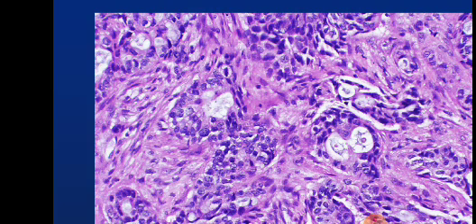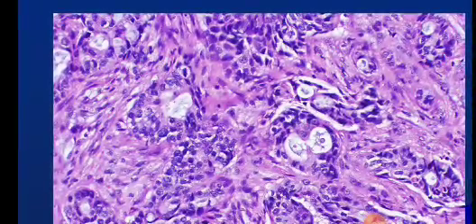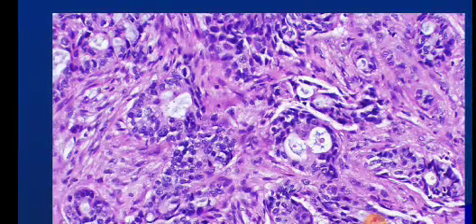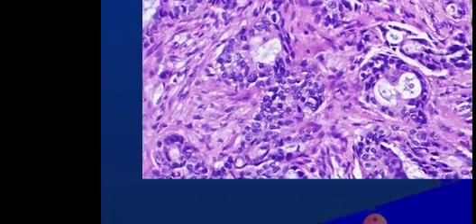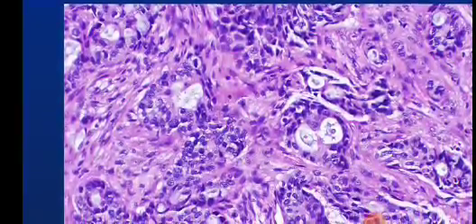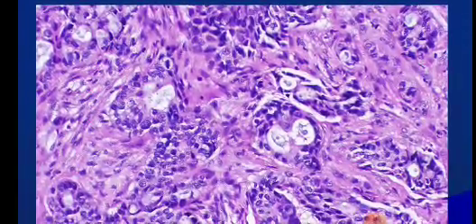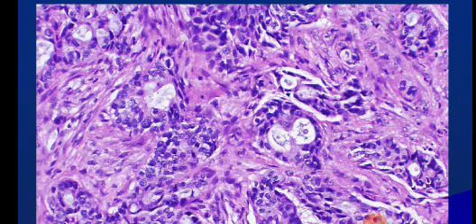Increased abnormal mitotic activity. How do we detect the mitotic activity? When the nucleus becomes irregular in shape, there is a straight line, or they form a Y-like structure or irregular figures inside the nucleus. This is known as a mitotic figure, and this is surrounded by fibrostroma, and you can see the malignant cells inside the fibrostroma. Means there is an invasion. Normally the cells are present inside an intact basement membrane, but here the basement membrane is not intact. You can see the invasion of the cells inside the stroma.